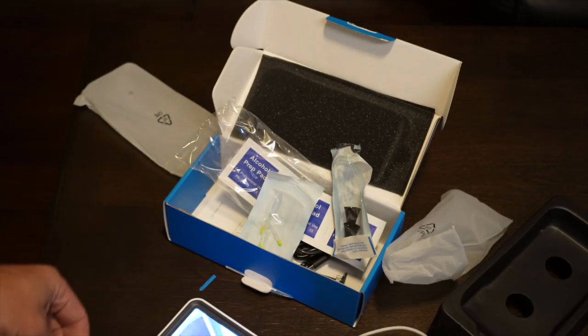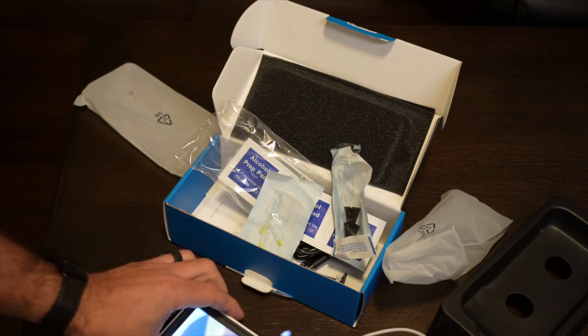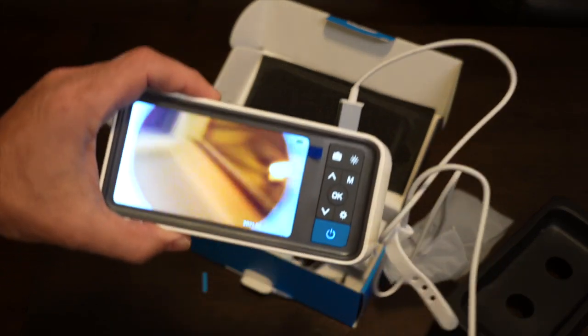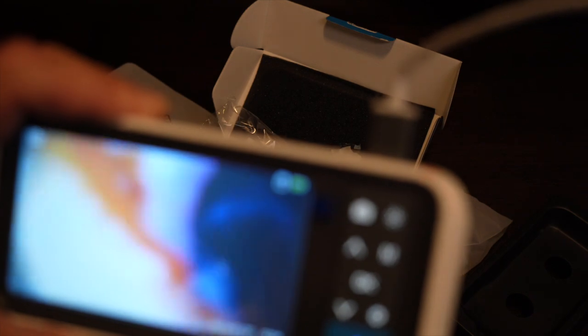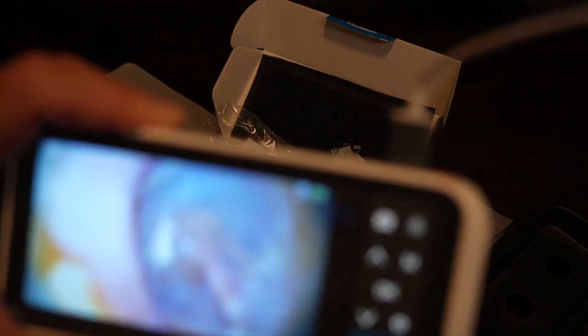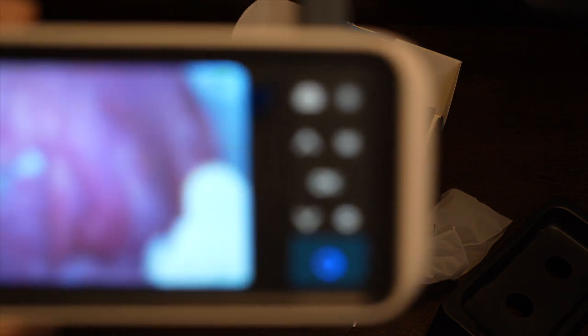These are not regular otoscope tips, not like you can use the regular Welch Allyn ones. It's got some kind of mechanism inside to fit to the camera so that it doesn't fall out. And then I'm introducing it into my ear, yeah, got a little wax there, that's no biggie, that's where it's meant to be. And you can see right there, the image is not great there because it's not on focus, but as you're going to see soon on the image that it captures, it's amazing quality.